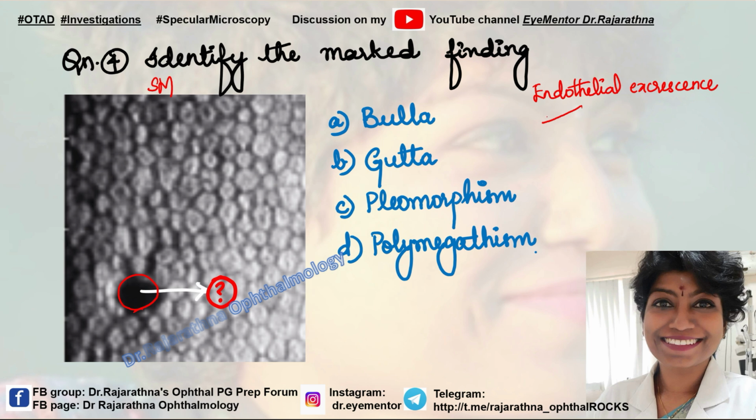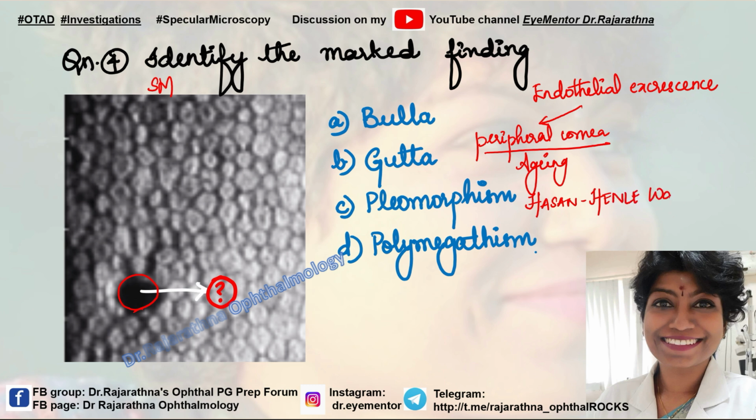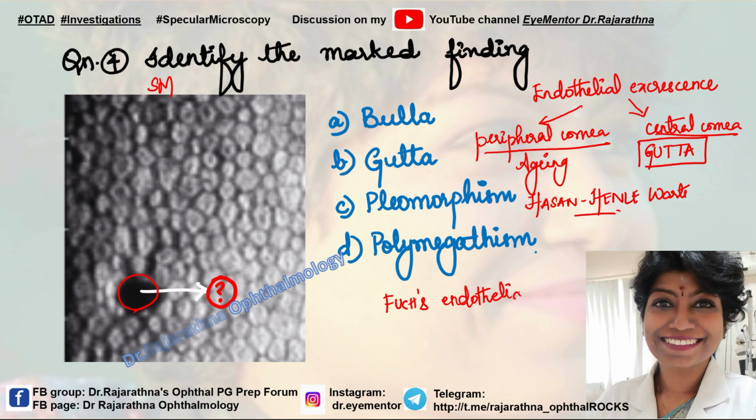Now this endothelial excrescence can be present in the peripheral cornea, which is a kind of physiological change that you see with aging in old corneas, where it's called Hassall-Henle warts. Now, if it is present in the central cornea, it's definitely pathological. This is also called peripheral corneal guttae, but when you use the word gutta, it is a central corneal endothelial excrescence characteristically seen in Fuchs endothelial dystrophy. So the hallmark of Fuchs endothelial dystrophy is a central corneal guttata, right? So this is gutta. Now, why is it not bulla?